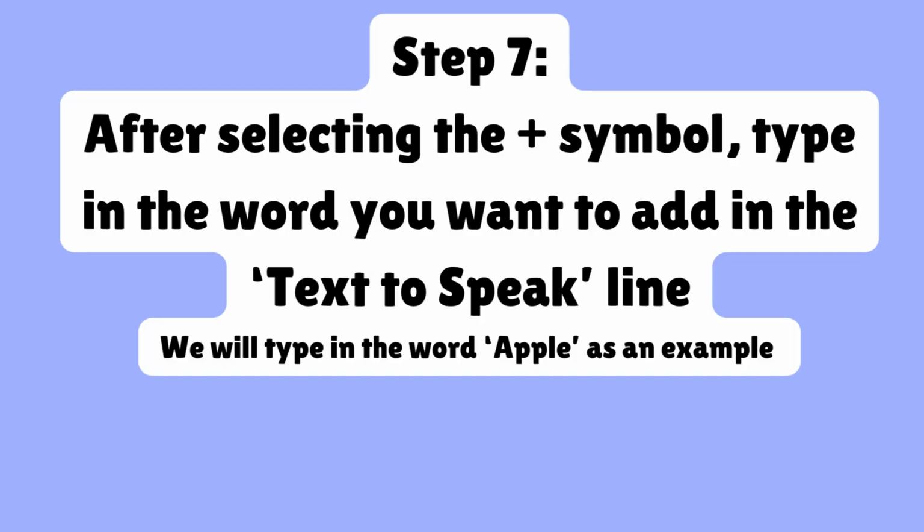Step 7. After selecting the plus symbol, type in the word you want to add in the text-to-speak line. We will type in the word apple as an example.